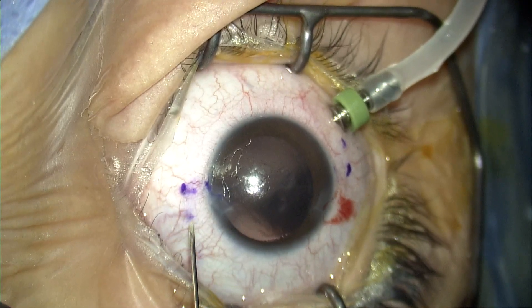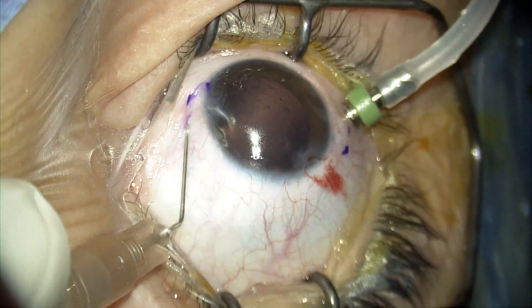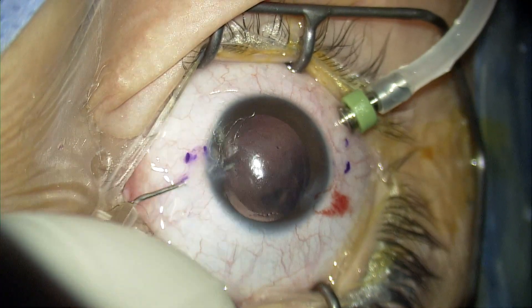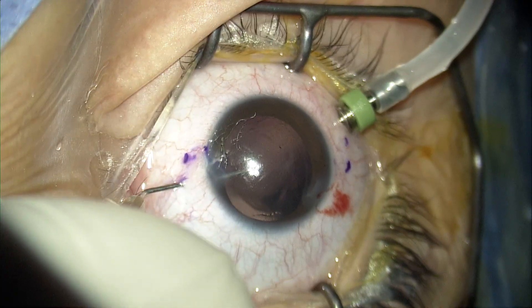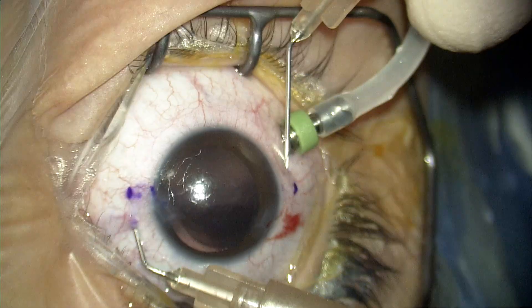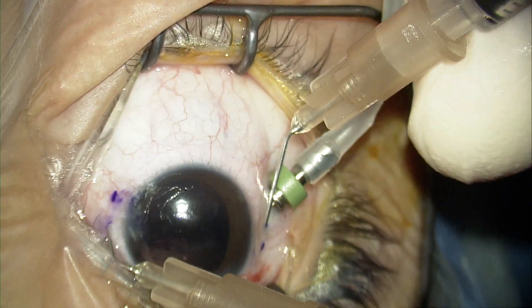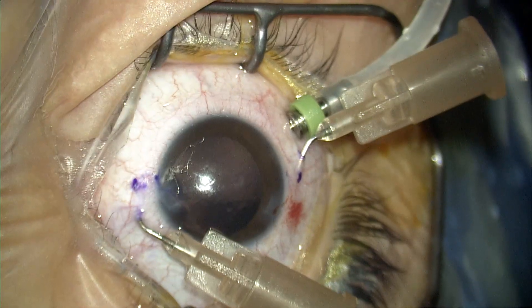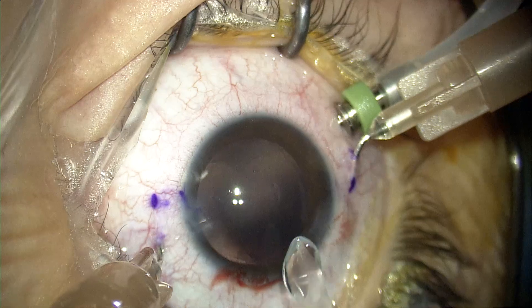Now that the subluxated lens is removed, I mark my reference points to delineate exactly how and where I'm going to place my 28-gauge needles. You have to place the needles — or the entry points into the eye — exactly 180 degrees apart in order to avoid any lens tilting. You have to clearly mark your positions to have everything in the proper alignment.